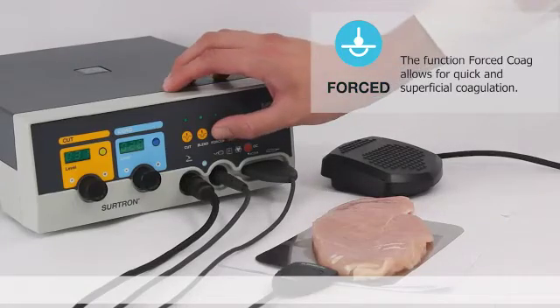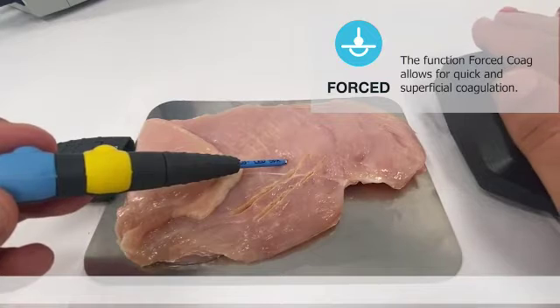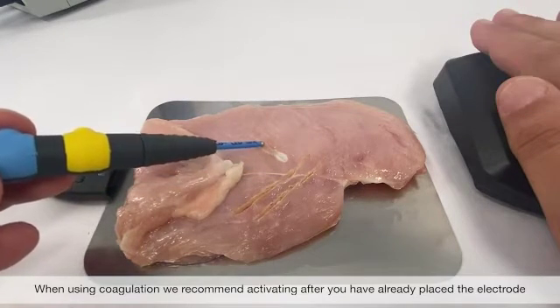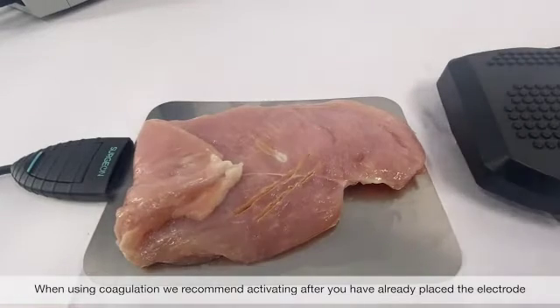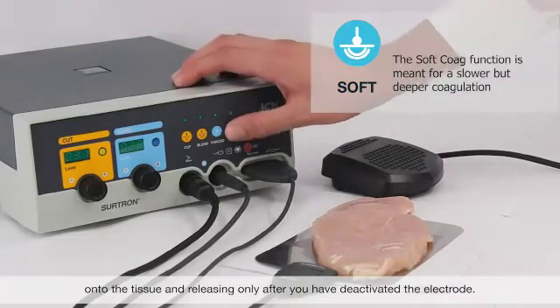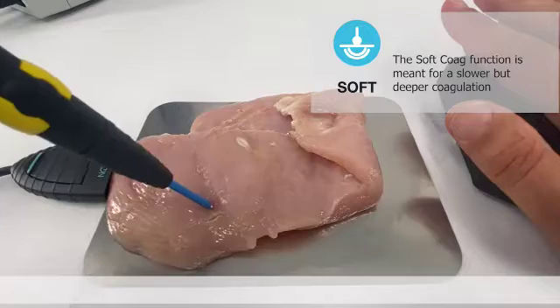Forced coag: this function allows for a quicker and superficial coagulation. When using coagulation, we recommend activating after you've already placed the electrode on the tissue, and releasing only after you've deactivated the electrode. Soft coag: the soft coag function is meant for a slower but deeper coagulation.